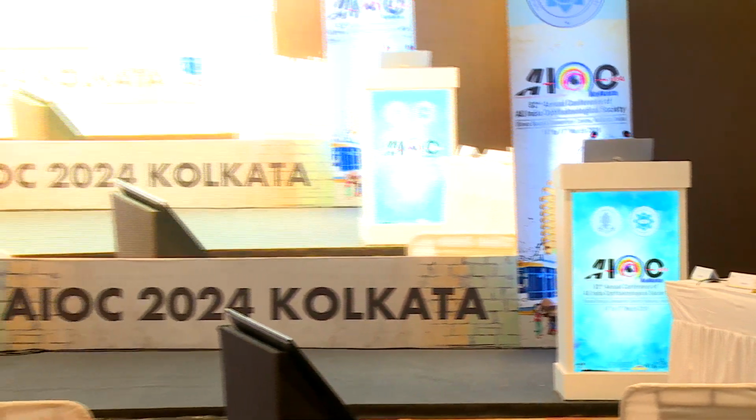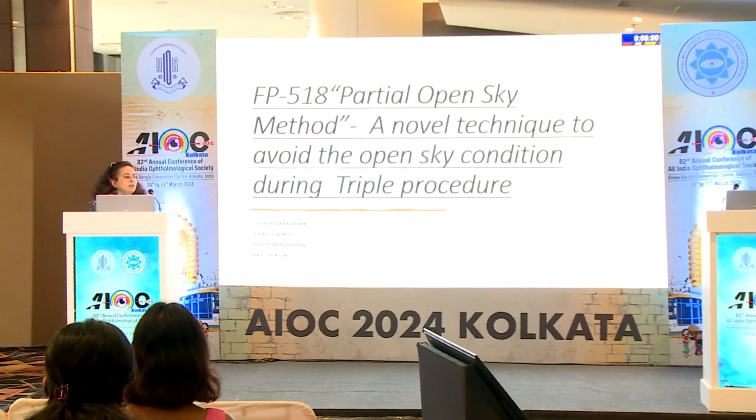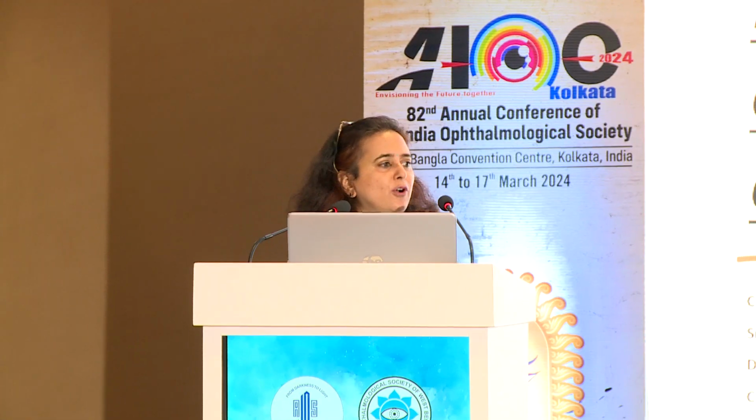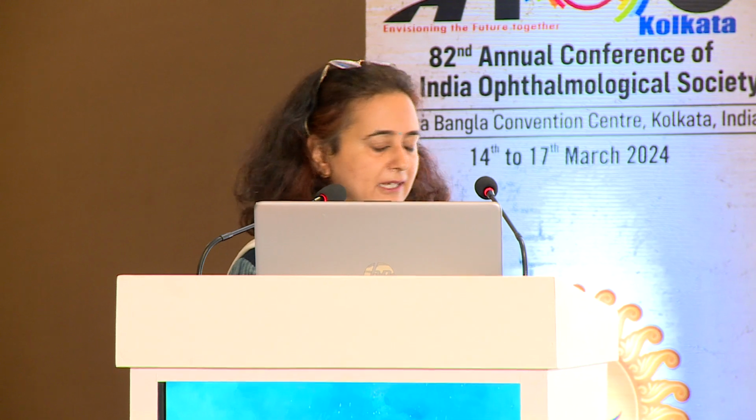Good morning, everyone. I shall be speaking on a minor modification of an open sky technique. My topic is partial open sky method, a novel technique to avoid the open sky condition during TPK procedure.